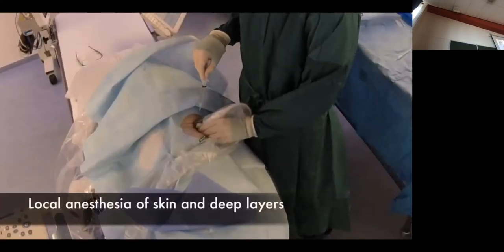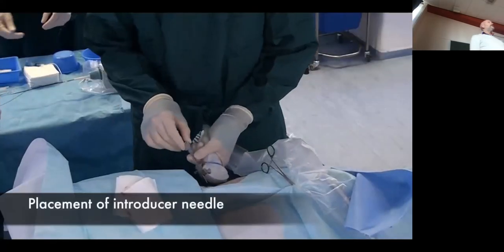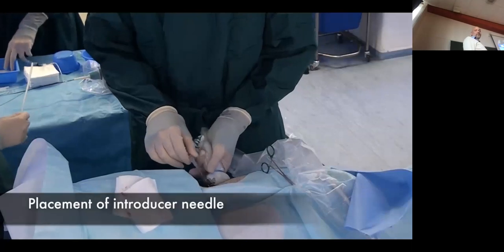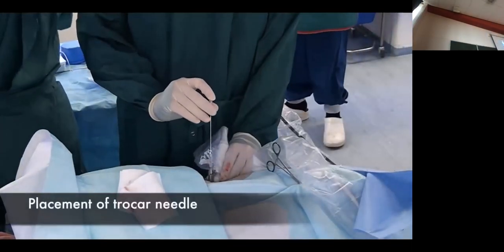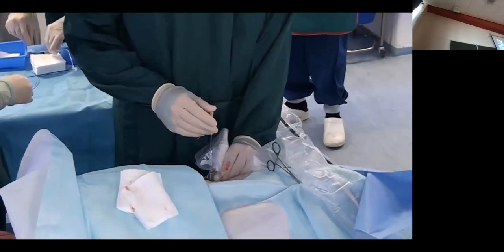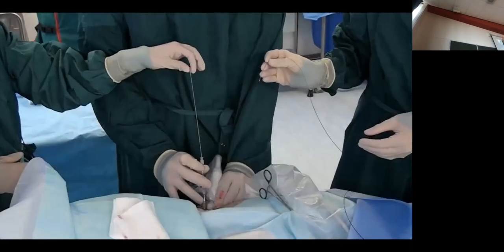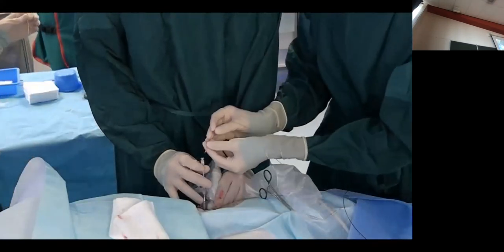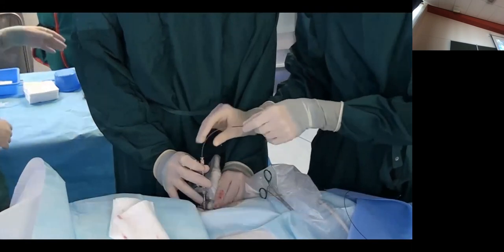This is an actual patient. And if we bring in a needle here to anesthetize the tissue, so there is not too much pain from the needle itself. Then we create a hole with what we call a trocar needle, but then tiny. A metal needle that you can bring down there into the tumor. And we take out this core, and suddenly there is a needle within the lesion of the patient.